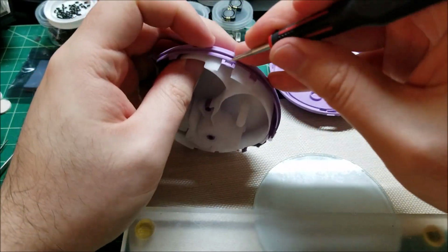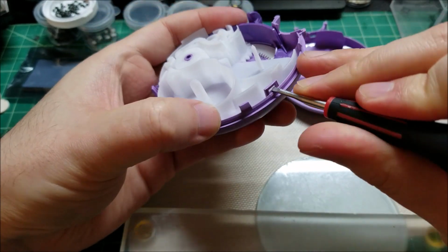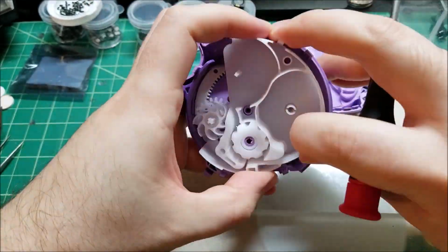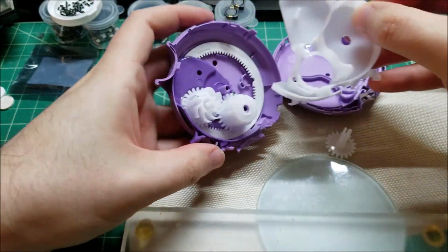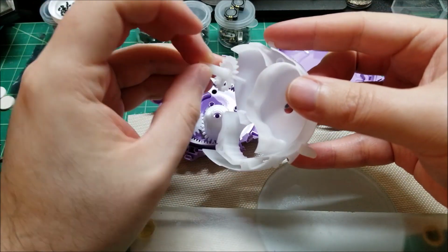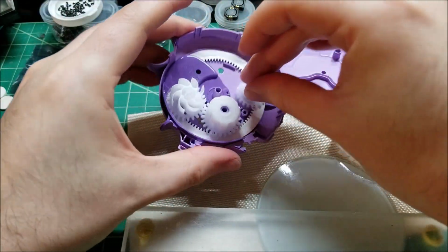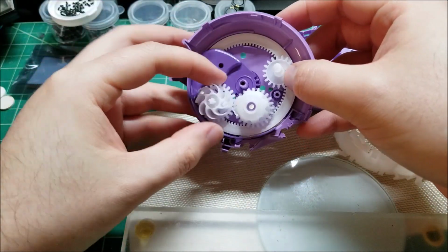And there's little plastic tabs holding this mid frame in, so I can just quickly undo that. Okay, so yeah, a lot of things are clipped in. So we have this guy went in, let's see, how did this go? Somewhere about here. So yeah, like I thought, it's exactly like a calendar wheel.